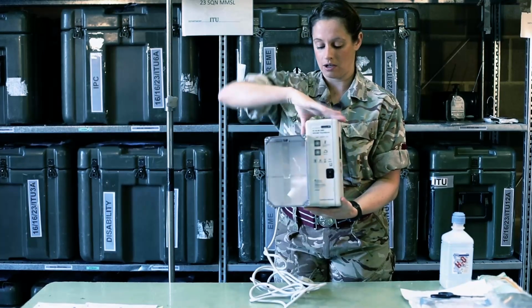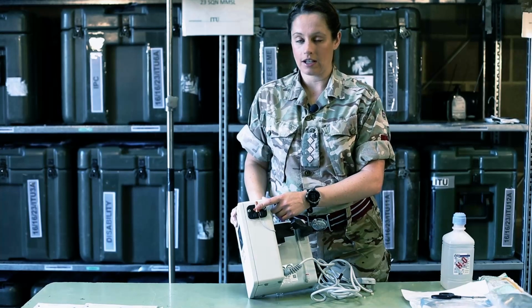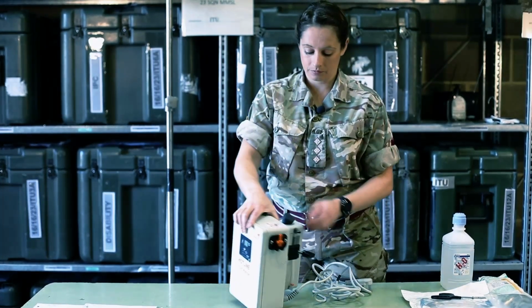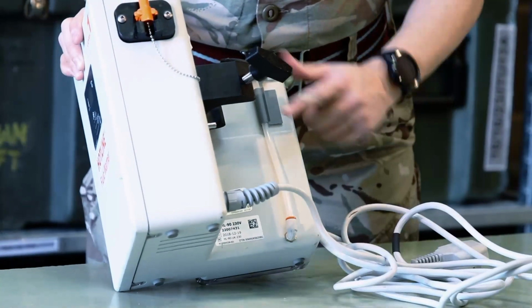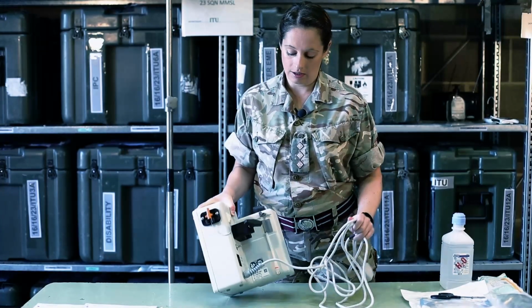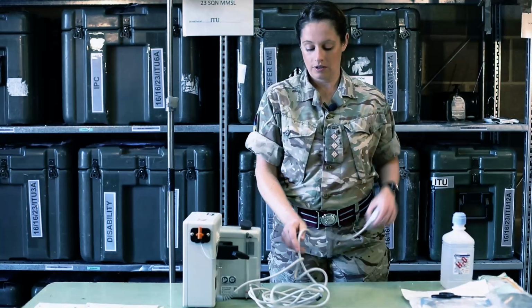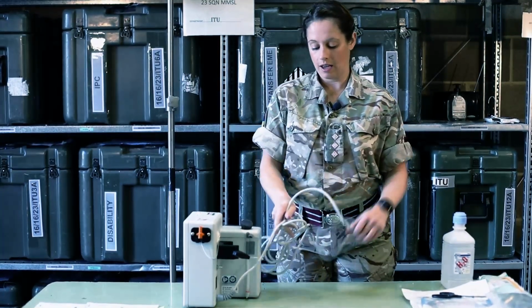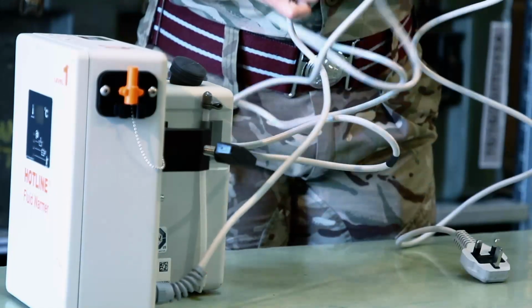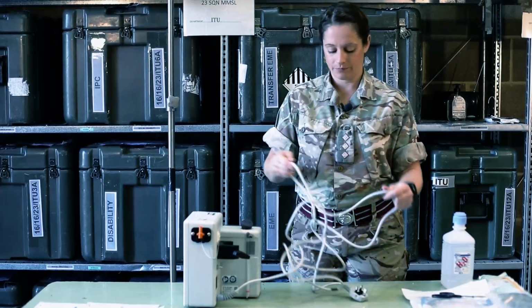and that you're not missing any parts. Things that often go missing are the port cover, the rubber plug and the straw at the back. The other thing to check is the electrics, and to make sure that there are no wires that can be seen that are external. And on the wire, the MDSS team placed a marking at 107 centimetres to denote how high it should be off the floor, or no higher than 107 centimetres off the floor.